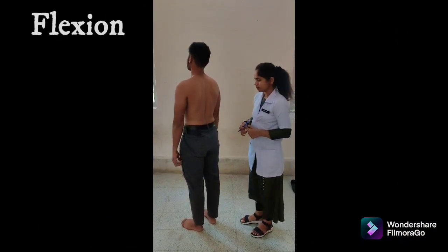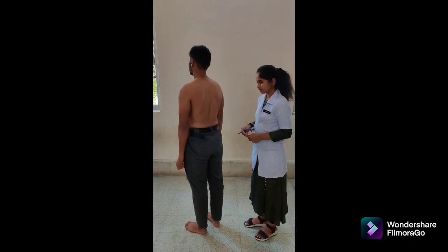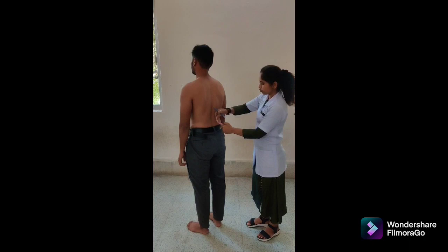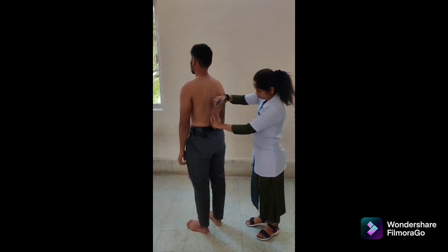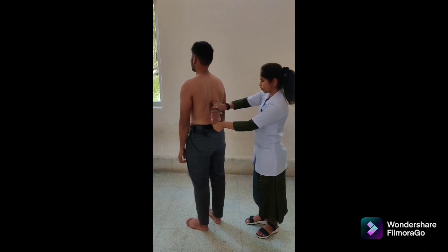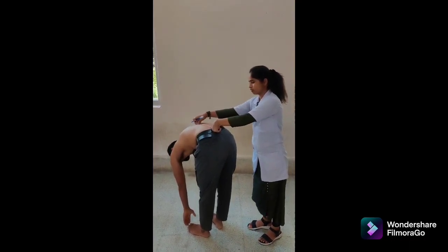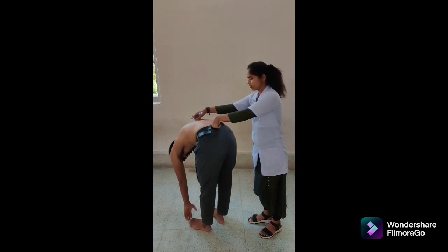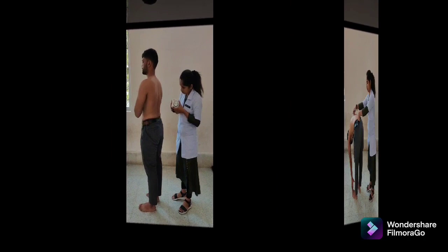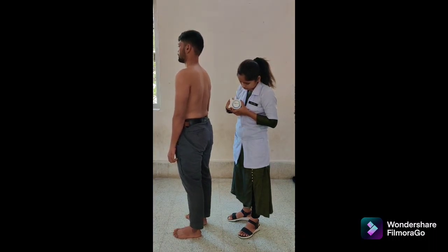There are three methods to measure lumbar flexion range of motion. First is the modified Schober test. Patient position: standing. Tape alignment: place a first mark at the spinous process of S2, and a second mark 15 cm above the first. Align the tape between the two marks and record the distance. Instruction: bend forward as far as possible while keeping the knees straight. Maintain the tape against the back during the motion. At the end, measure the distance between the two marks. The range of motion is the difference between 15 cm and the length measured at the end of motion.